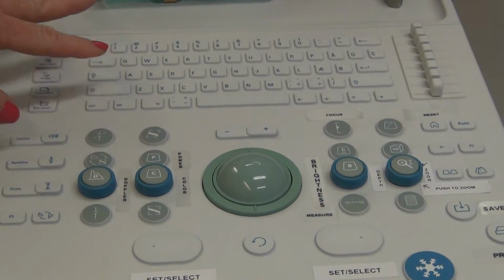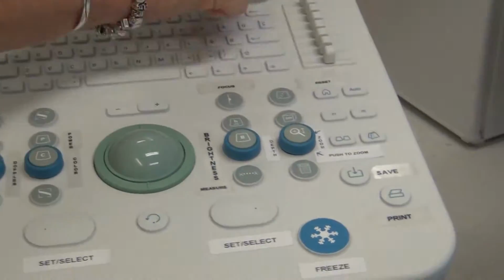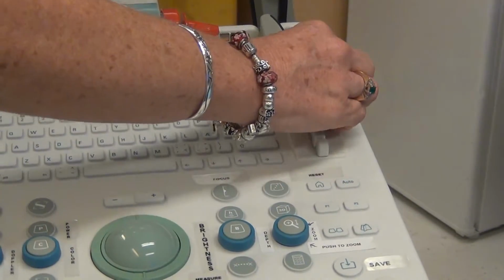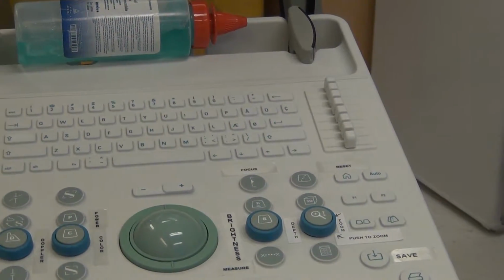We've already put the patient information in. We want to make sure that these buttons here are in the middle where the dots are. If you look, you can see dots that are in the middle. This is your TGC, or your time gain compensation. It's the fine tuning of your brightness.